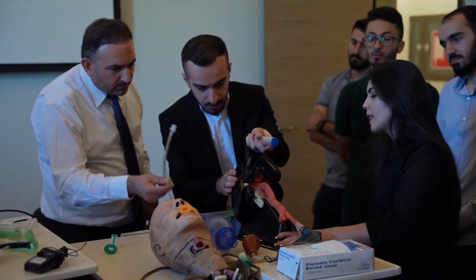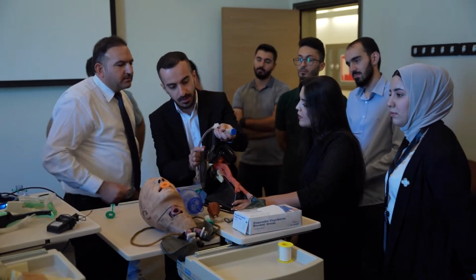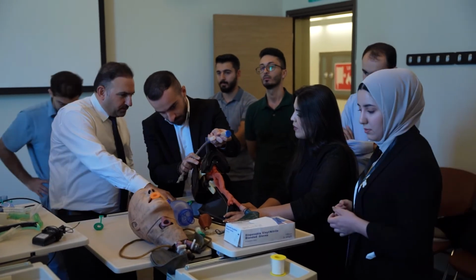On the right side. And elevating it. Yes.